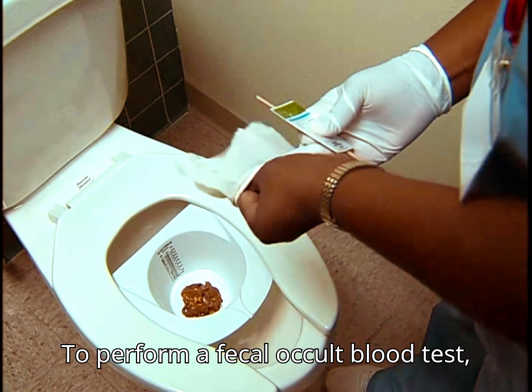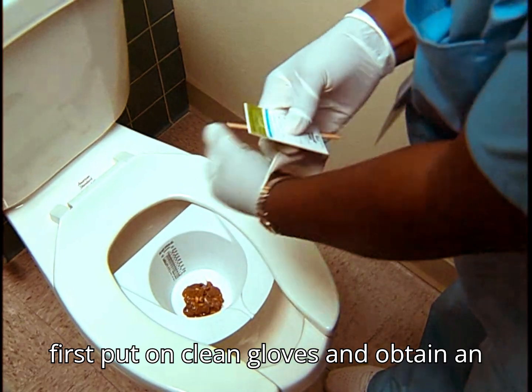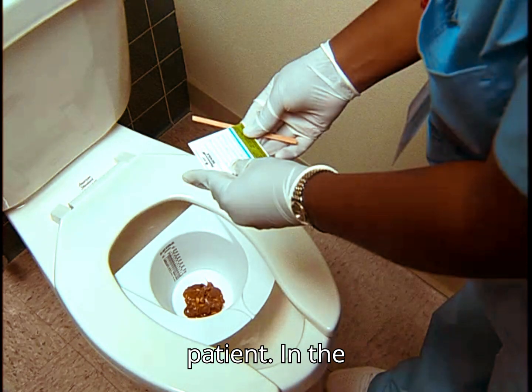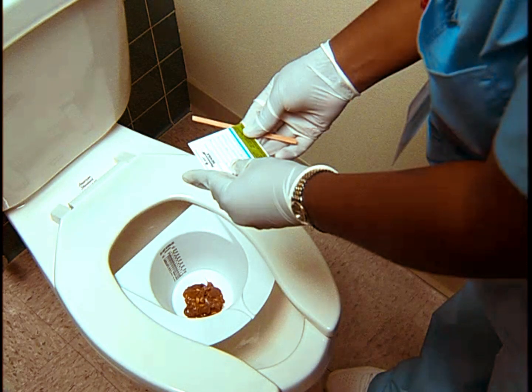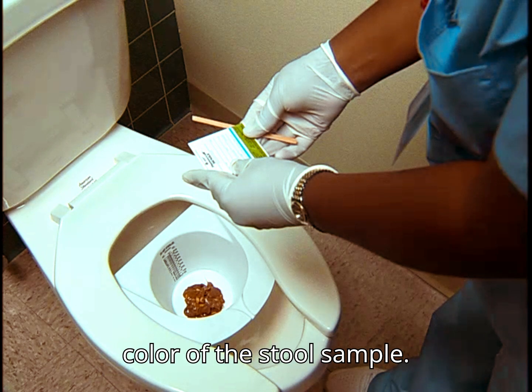To perform a fecal occult blood test, first put on clean gloves and obtain an uncontaminated stool sample from the patient. In the bathroom or a dirty utility room, observe the amount, character, and color of the stool sample.